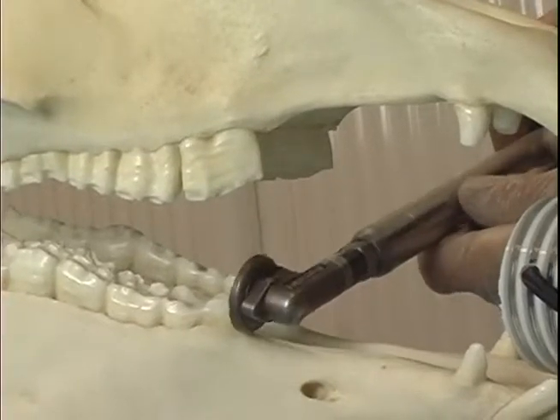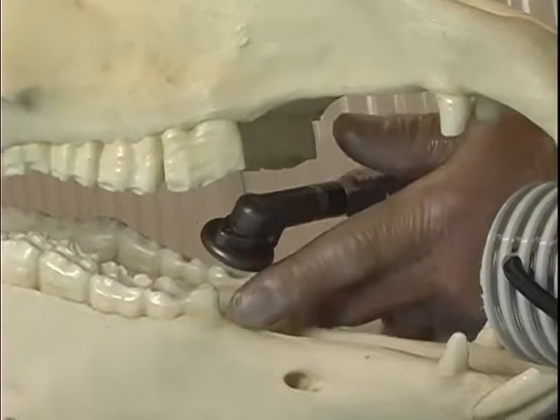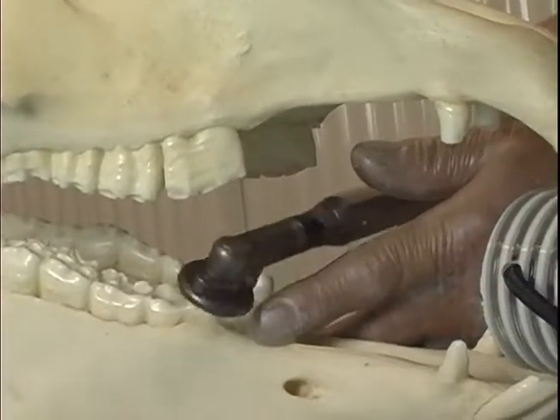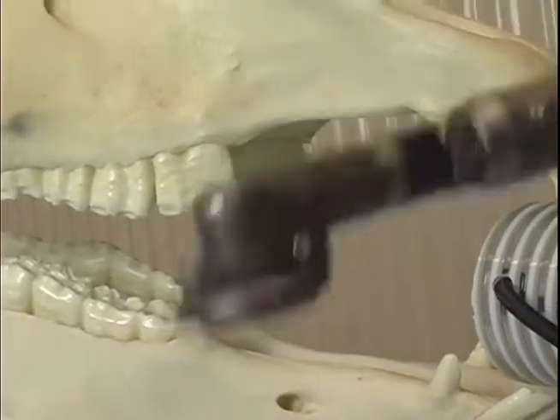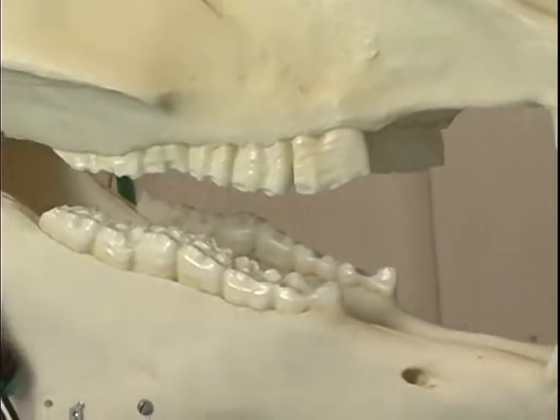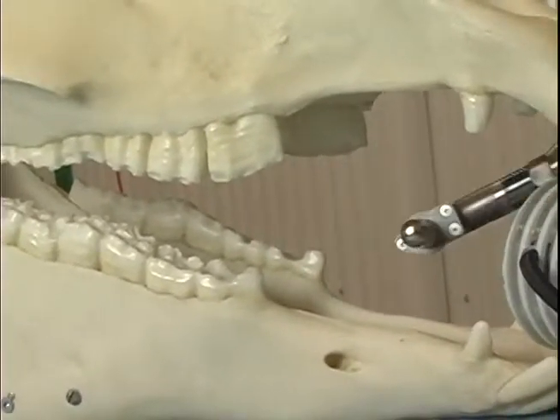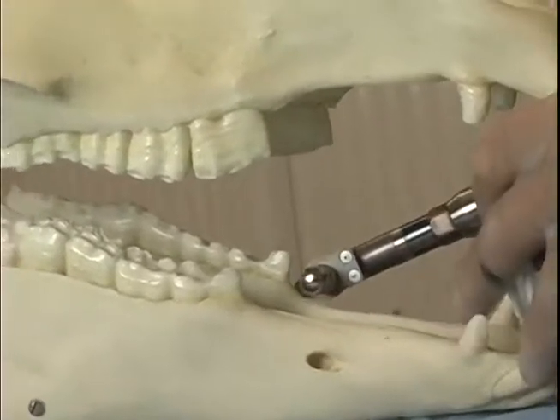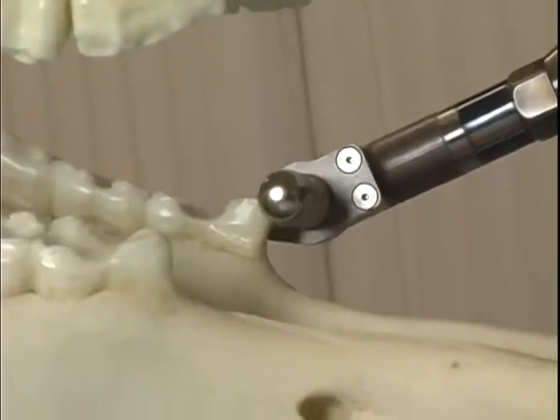On the lower arcade it can also be done, but the mandibular frenulum in this area can get in the way, and you have to pull it aside to get to it, inside and out. There's a technique to do that. However, it's easier for me to go in the mouth with this apple core and blunt the front edge of this tooth.